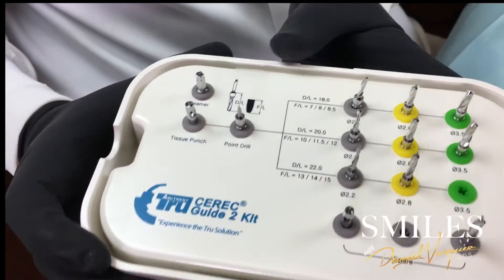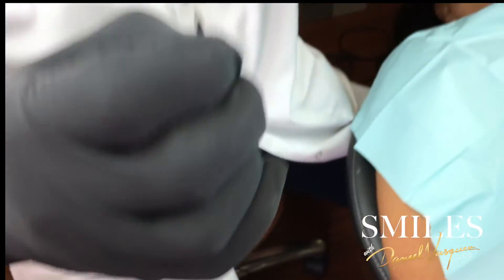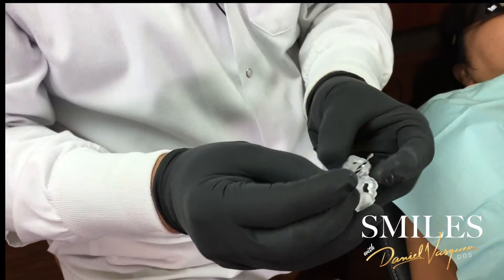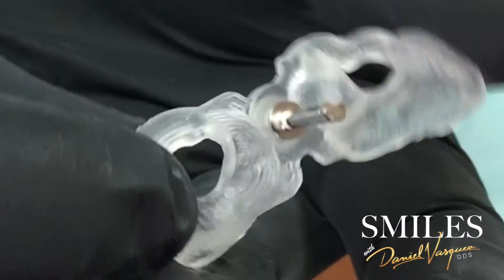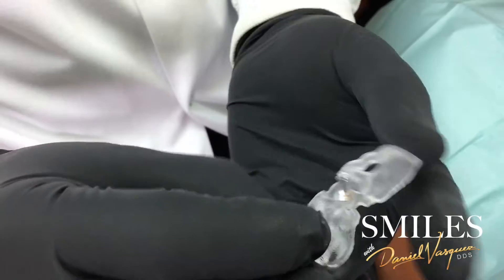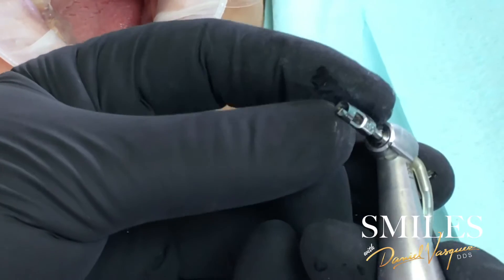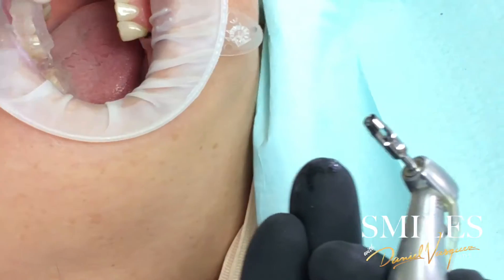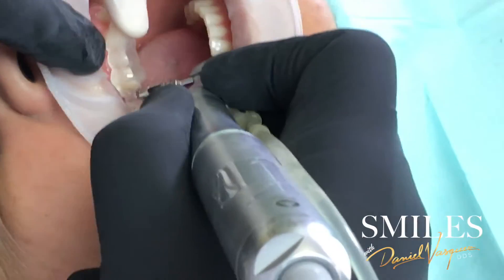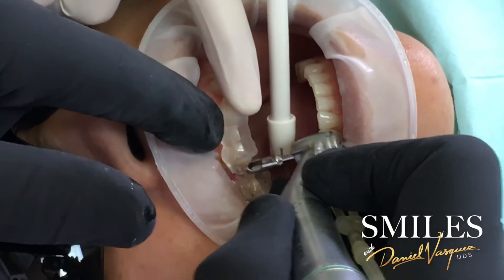One of the coolest things about this — so this is a Sari Guy 2 — the fit is just perfect, as you can see. It's a nice punch hole. It has an internal cutting, so at the same time that it's punching, it's removing the tissue. So it fits very nicely in my guide.